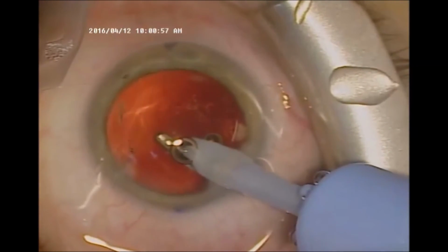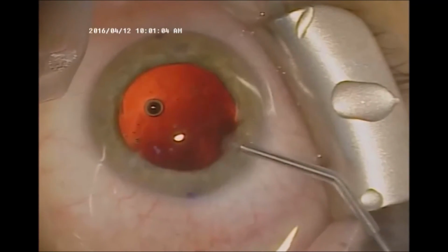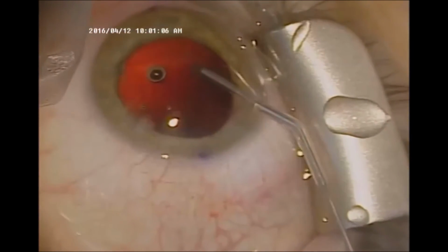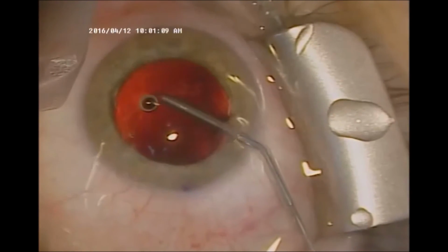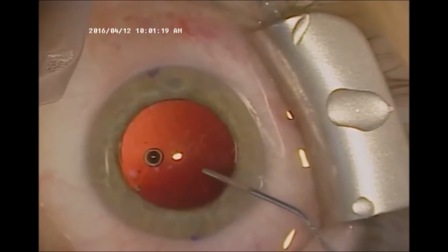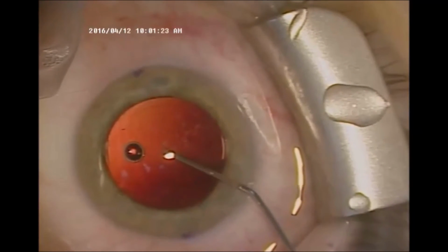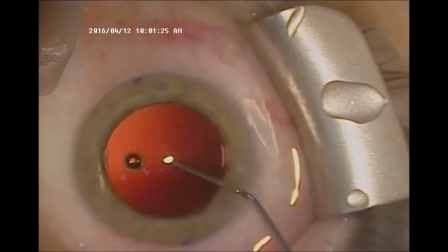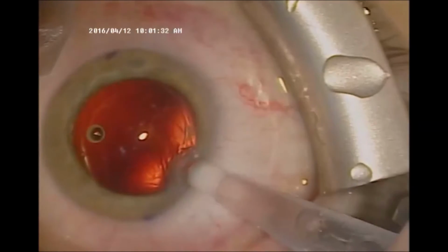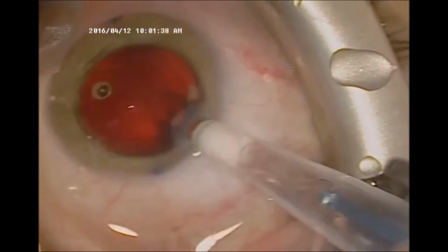Now that all of the cortex or the remaining lens material has been removed, I use a silicone tip in order to free up any remaining lens material that I've missed, called polishing. Here I inject the eye with viscoelastic again to make sure that it's firm, so that I may place the new lens. Here I am placing a Technis multifocal lens, one that will allow the patient to see both far away and up close.